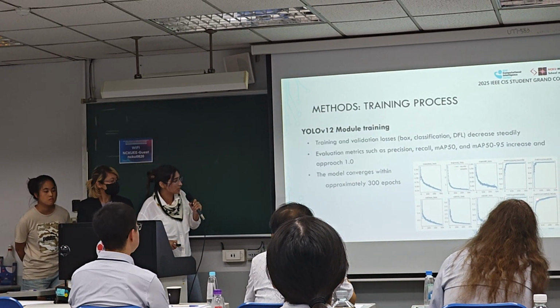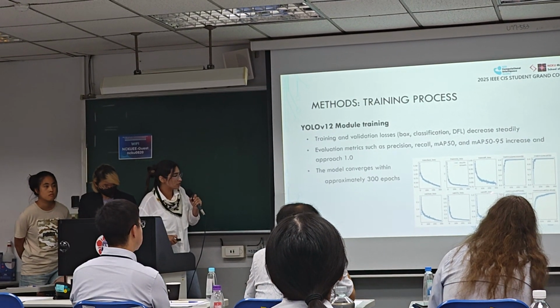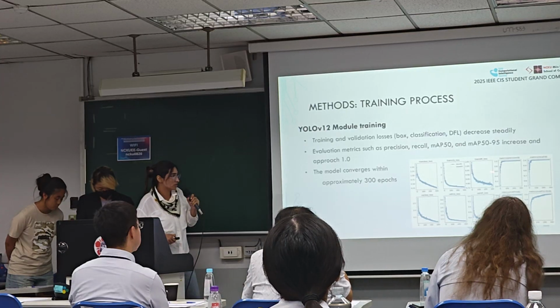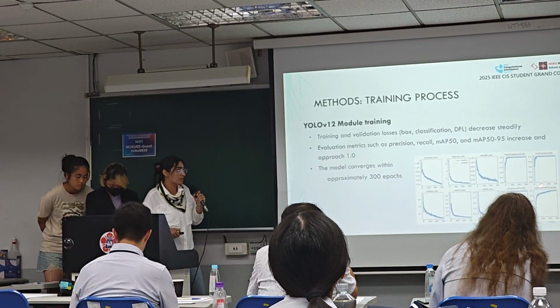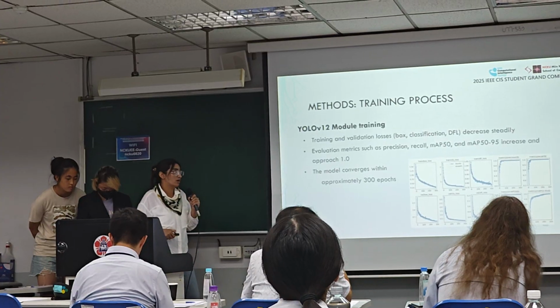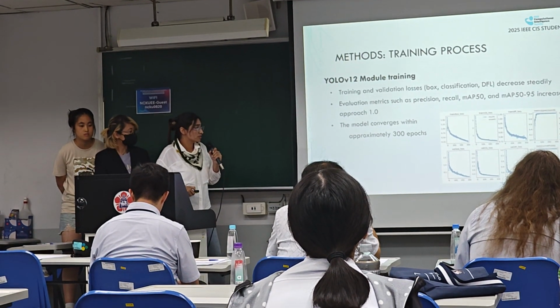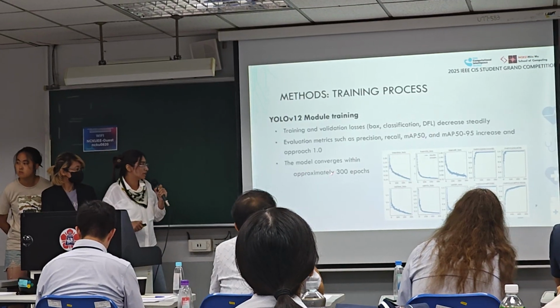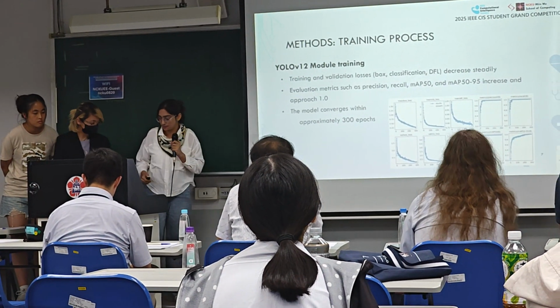You can see it increases gradually and reaches the point 1.0. So in these pictures, you can see that we got our results near 1.0. It means it supports our RBC image analysis results according to our main goal. We got these results by doing approximately 300 training cycles.